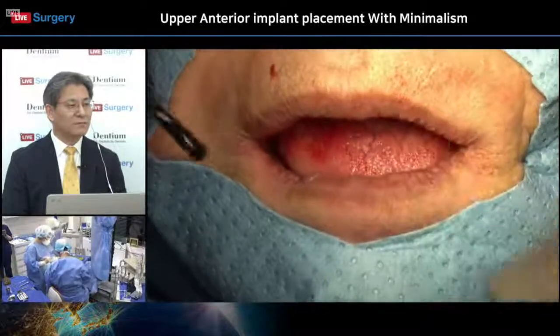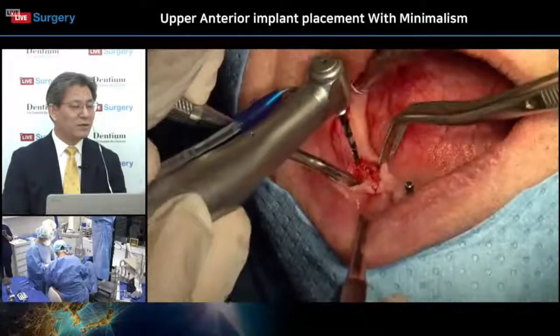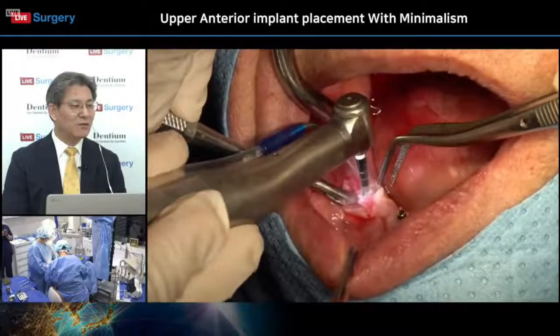So he is moving to the lingual part, lingual positioning a little bit more.